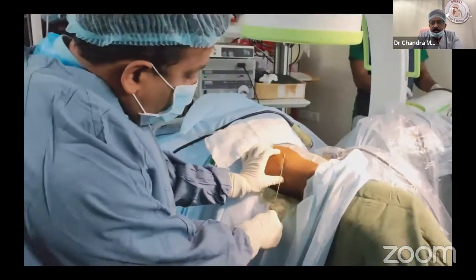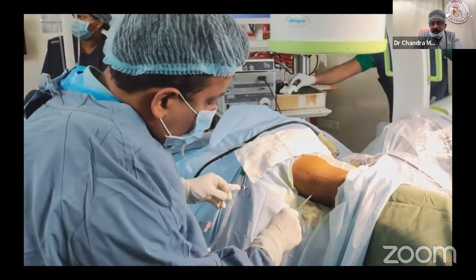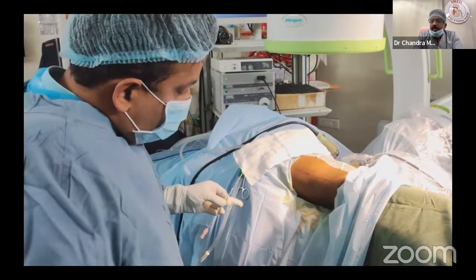The calyx is coming just below the rib here. Normally in prone PCNL we go below the rib. So in this position, more posteriorly, I am putting the needle blind. This is the blind part of the supine PCNL, in prone PCNL also. Because it is a triangulation method, you have to approximately go somewhere around 3 to 4 finger breadths, but nobody can tell. The approximation in supine PCNL is much easier because it is horizontal.